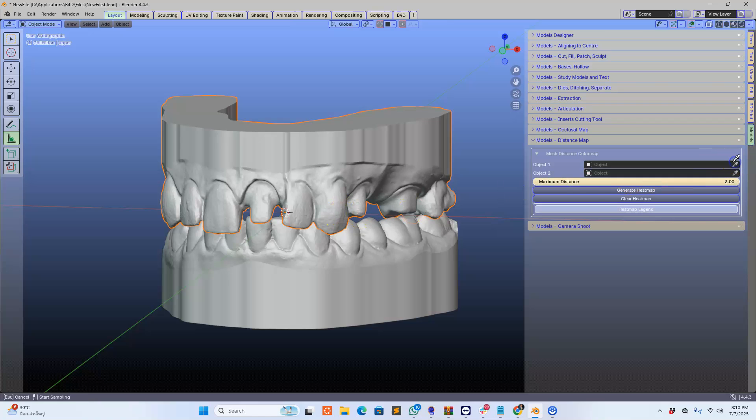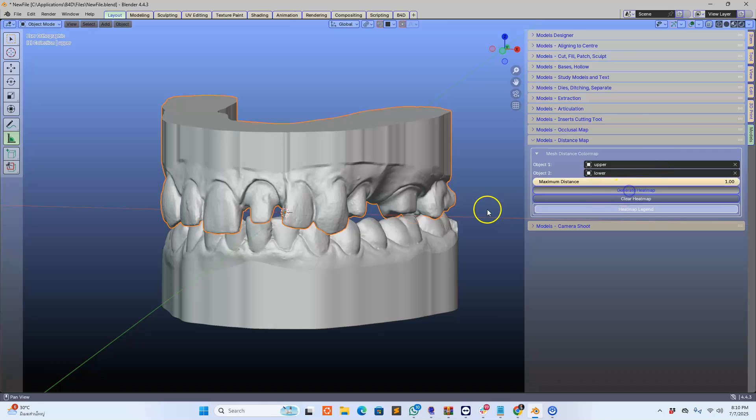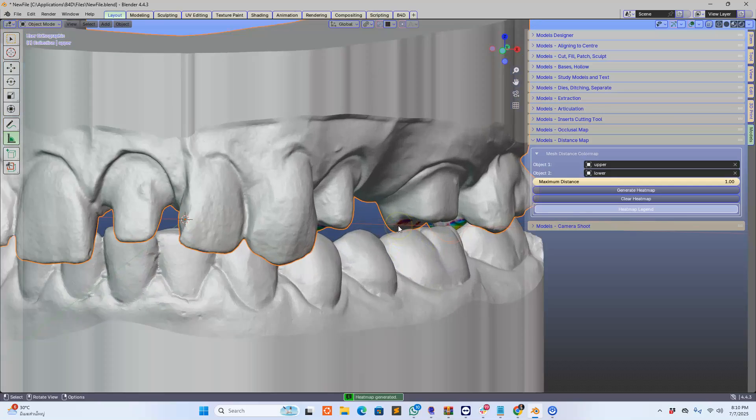Take the dropper and select your model, and this is the other model, select it. Then we're going to put maximum distance, say one millimeter, and generate the heat map.